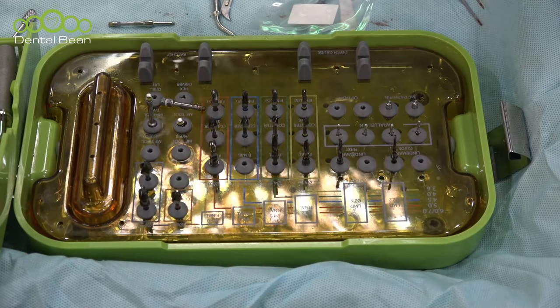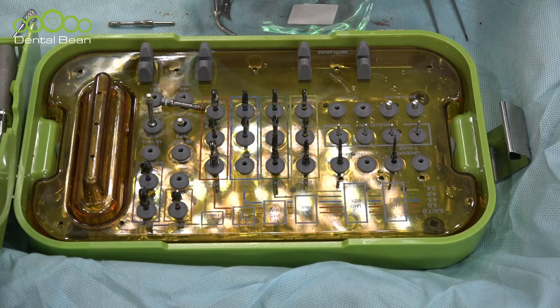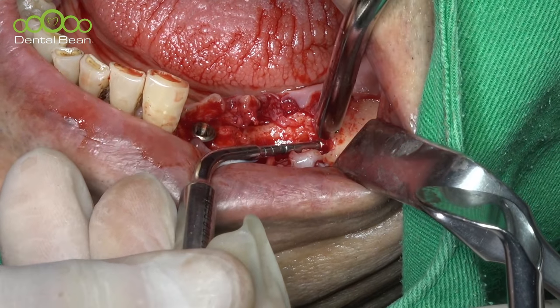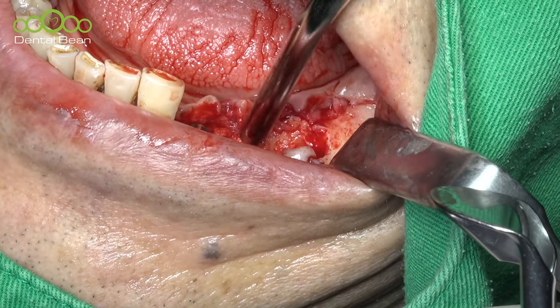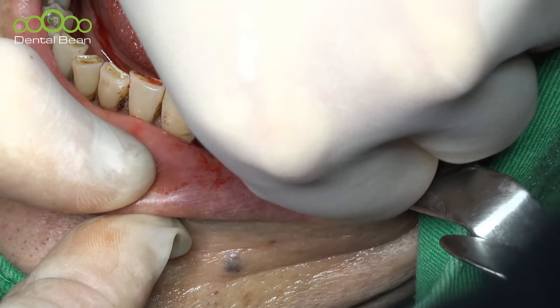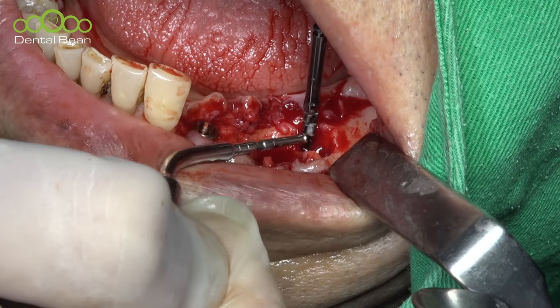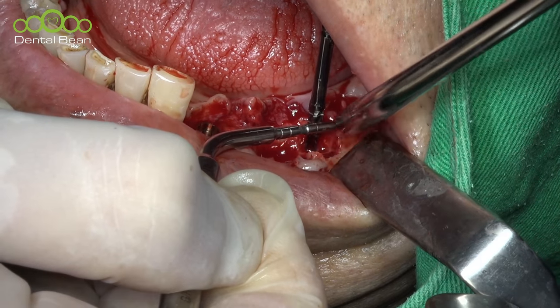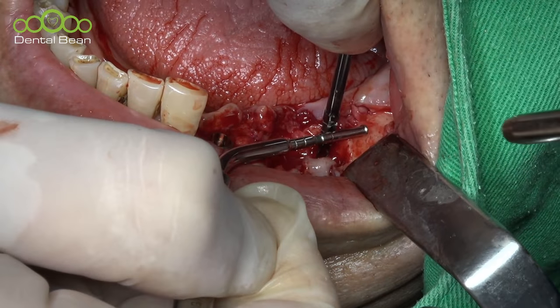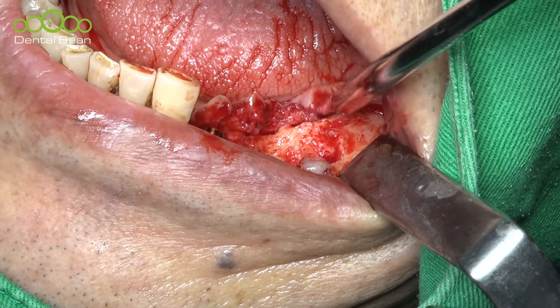At this time, your view to the adjacent marginal bone area. So 10 millimeter means this is the 10 millimeter guideline, not here. So this drill, for example, immediate placement is the same. At this time, this is the drill here. At that time, the 10 millimeter length is here. So this is the 8 millimeter, 10 millimeter. So repeated dissection, we have to keep this depth like here. I think a little bit 1 millimeter deeper is better. 1 millimeter deep.